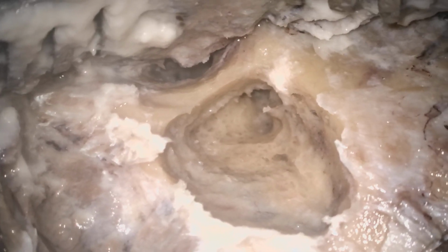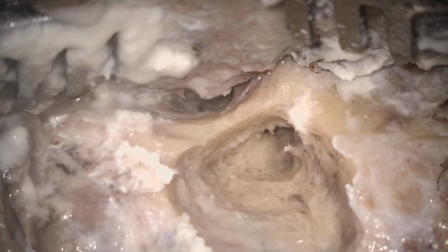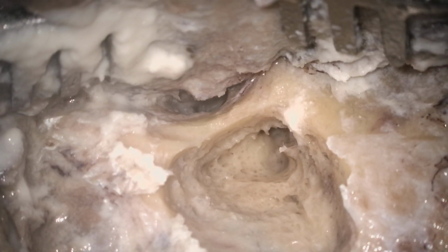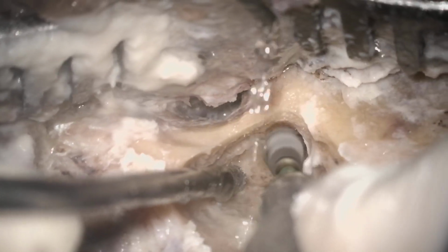If the position of the microscope is like that, then you cannot understand how much the thickness is or how anterior you can go. So for cortical mastoidectomy, you have to put your microscope in the proper alignment. There should be a proper head-on view, so that you can assess the thickness of the external auditory canal.